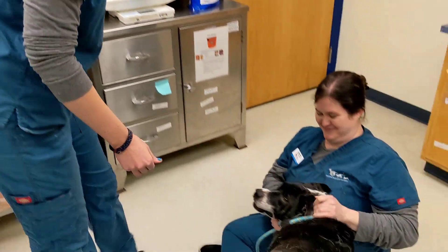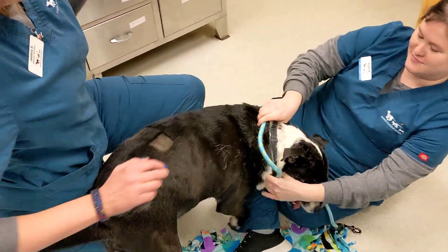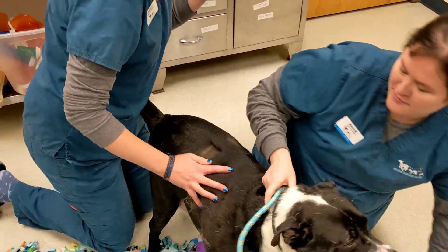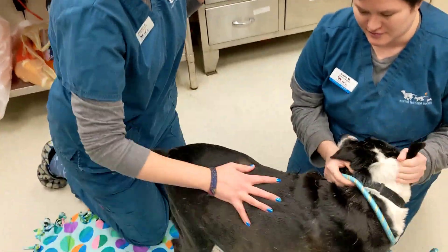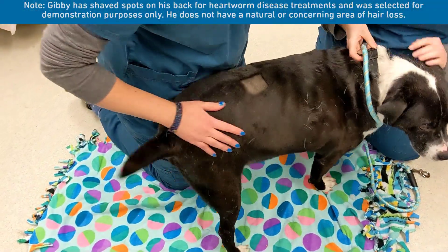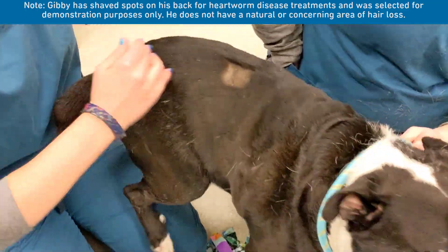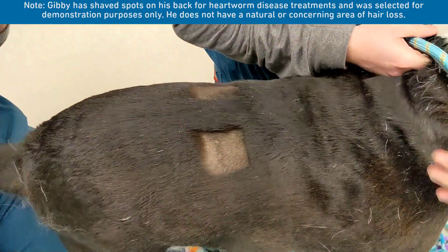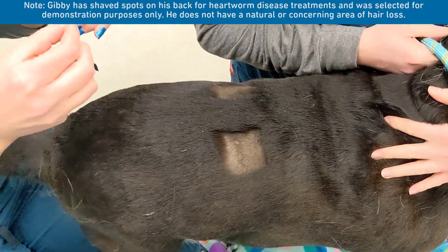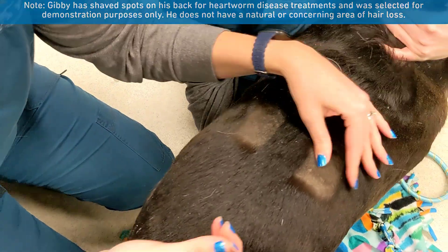This is our big dog friend, Gibby. An animal that needs a skin scrape is typically going to have an area of hair loss. Sometimes that hair loss may look kind of scaly or scabby. So where we're going to want to scrape on an animal is right on the edge of the hair loss where the new hair is growing.